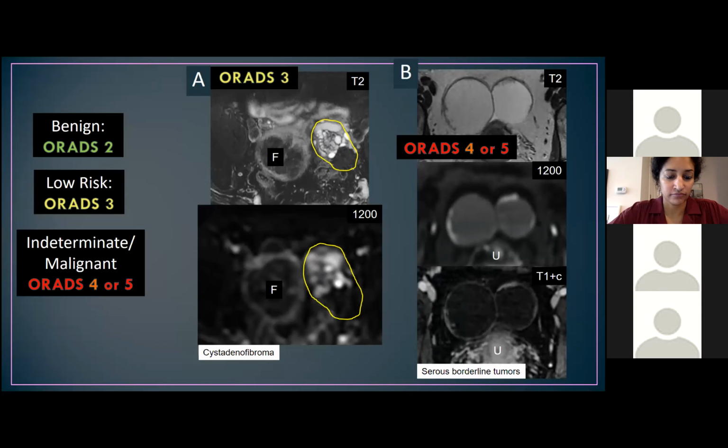So there's a little bit of a difference, but not a huge amount of difference. And I think if you have a 2 and it's benign, you're either going to follow it because it's a little on the big side, or you're going to completely ignore it. And when you go there, you'll see that's very similar to SRU.